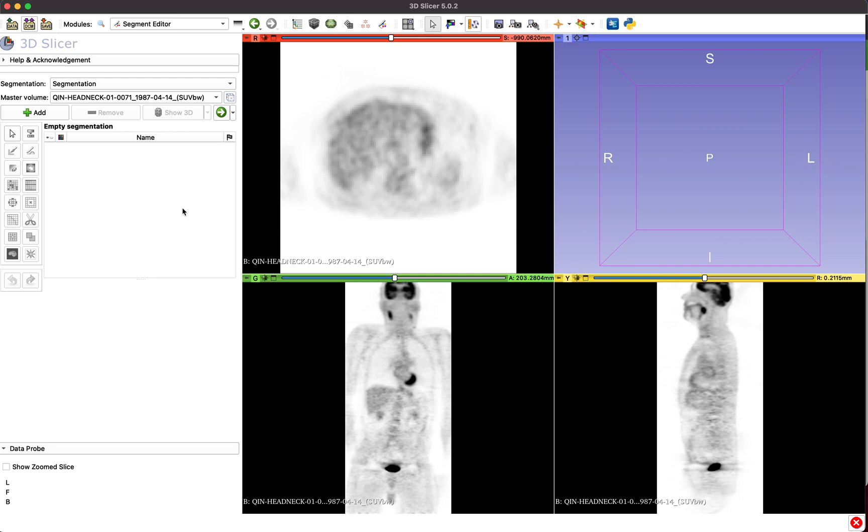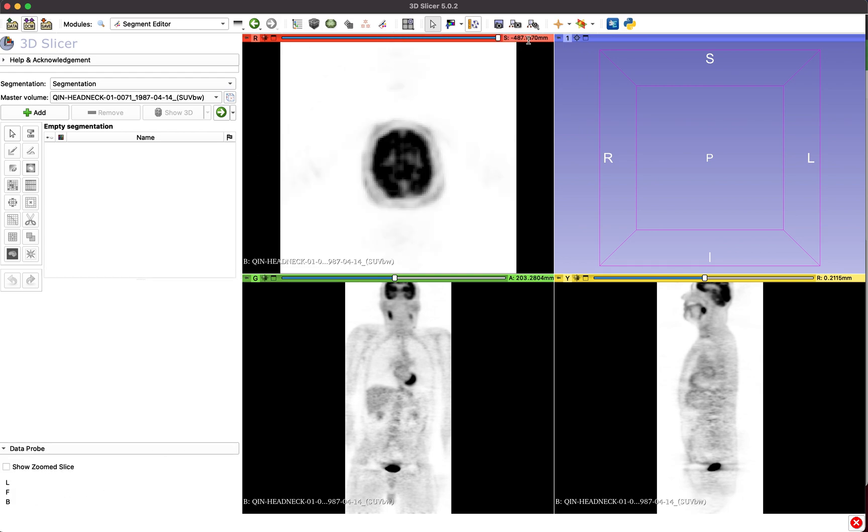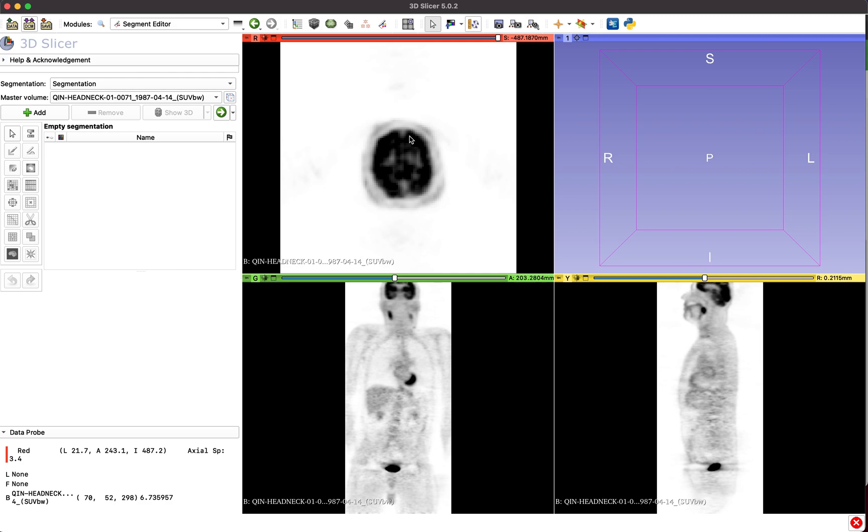To locate all lesions, we recommend searching through the entire dataset, top to bottom, using the mouse wheel.